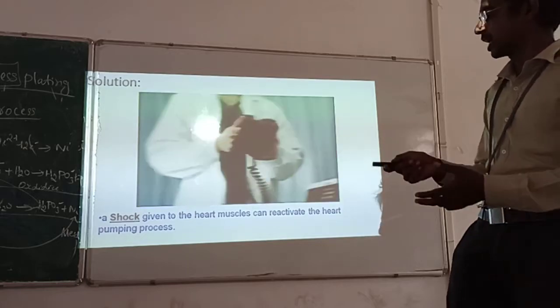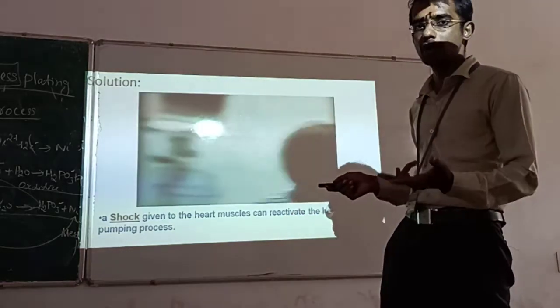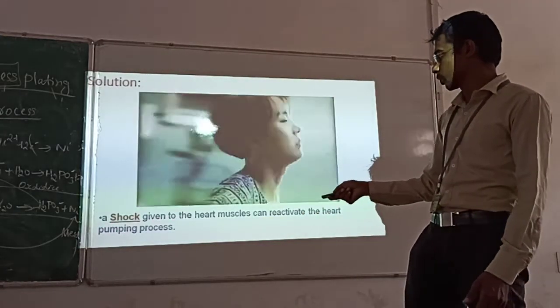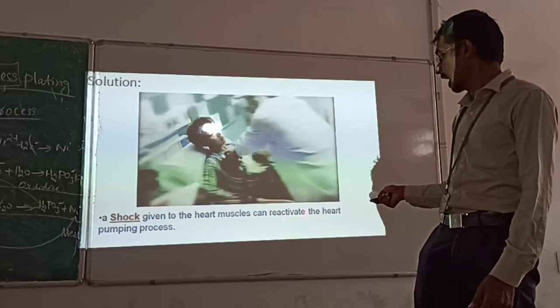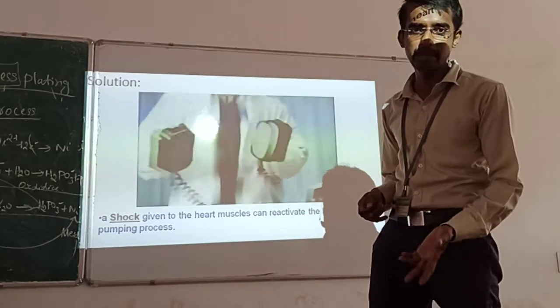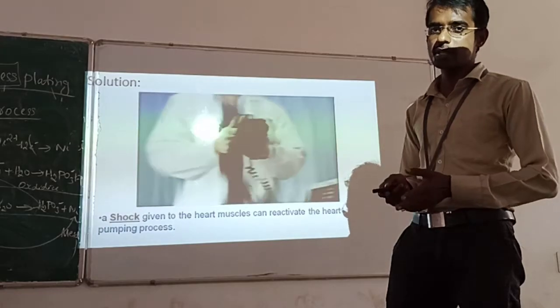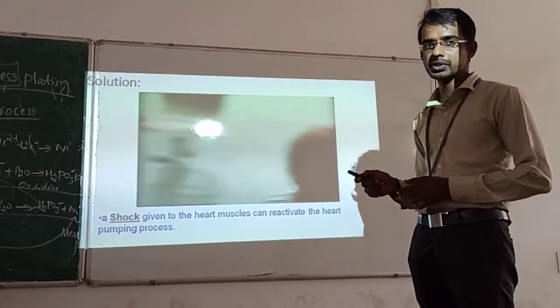When they place them for a momentary period, they give a high voltage shock. A shock is given to the heart muscles, which can reactivate the heart's pumping process. This is a fair means of trying. It will not always result in a 100% success ratio, but this is what actually happens.